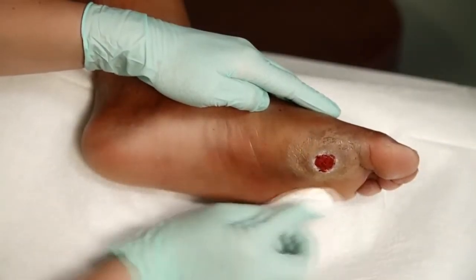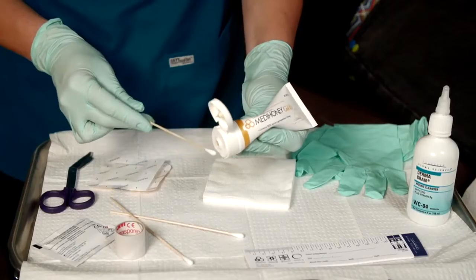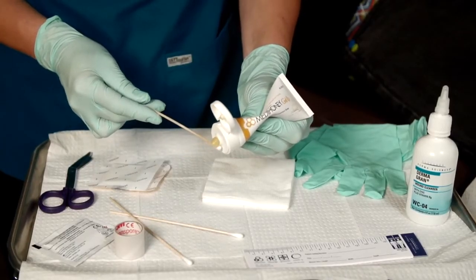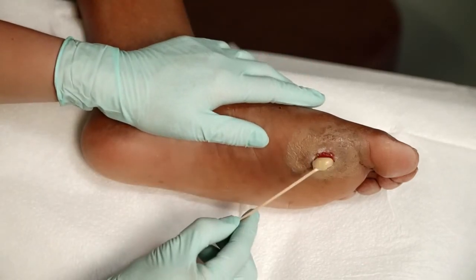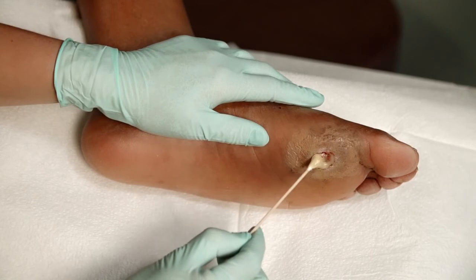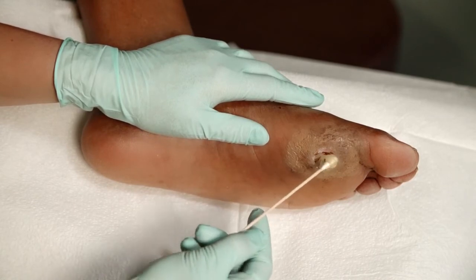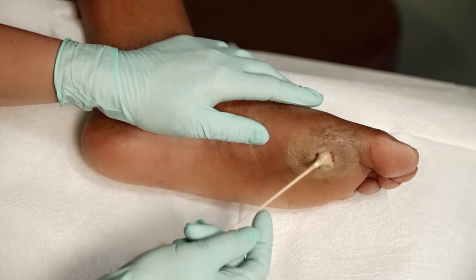After properly cleaning and preparing this diabetic foot ulcer, we apply a small amount of MEDIHONEY Gel onto an applicator. Using the applicator, place the gel into the wound bed, filling 80-90% of the wound bed at a nickel thickness, being careful not to apply the gel onto the surrounding healthy tissue.